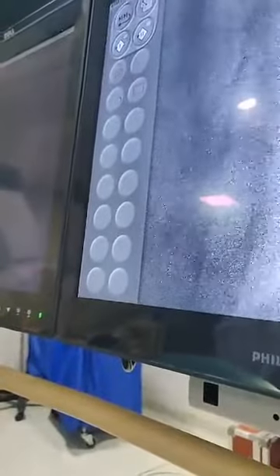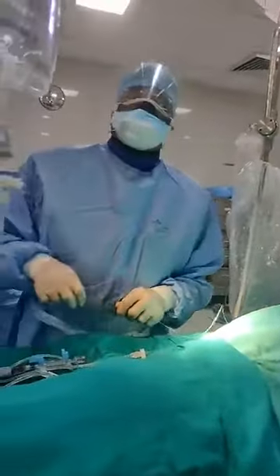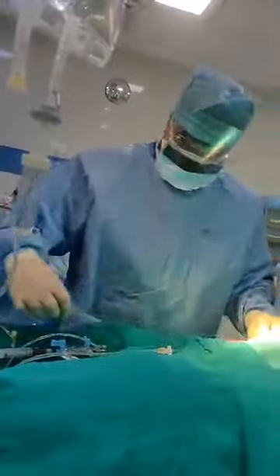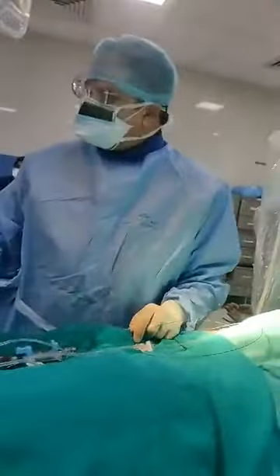This is the left main artery dividing into LAD and circumflex. This is how we are injecting the dye. The arteries have been visualized with the help of the guide, and now we take out the catheter and put in the right catheter — another catheter which is the right catheter. The procedure overall is not more than 10 minutes.